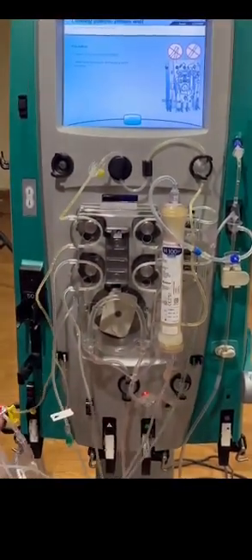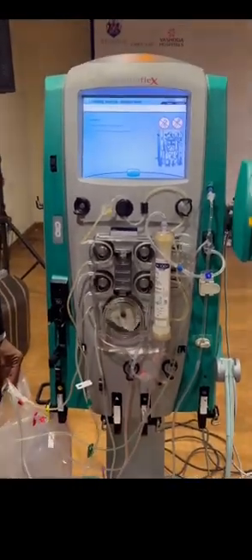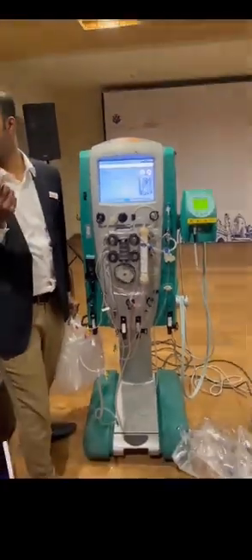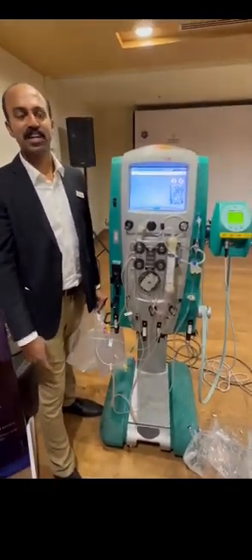As it is priming, usually to complete the priming process and shift the machine, it takes at least 40 minutes. For me, I need 25 minutes, but for all new ones, is there a way to make it faster? Because many times we want the patient to be on CRRT immediately, but then it takes at least 40-45 minutes to start.